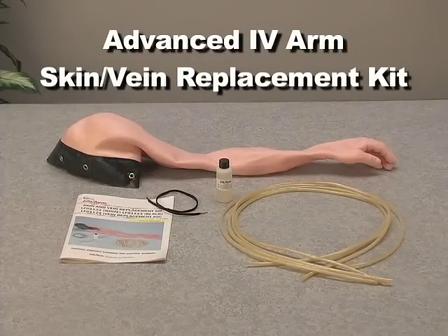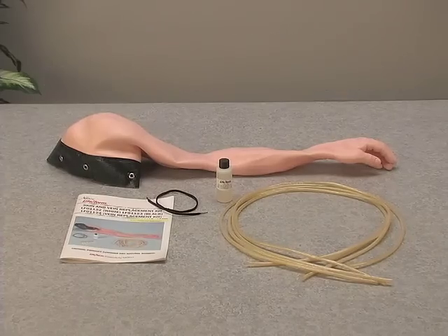Welcome to the instructional video for the NASCO Lifeform Advanced IV Arm Skin and Vein Replacement Kit. This video will enable you to easily change the skin and veins for our Advanced Venipuncture and Injection Arm by walking you through the process from start to finish.